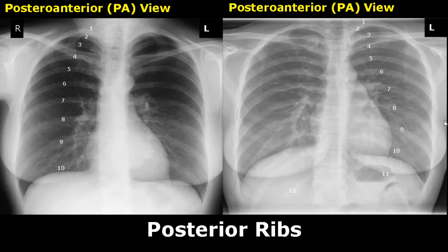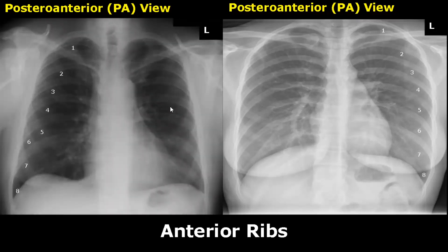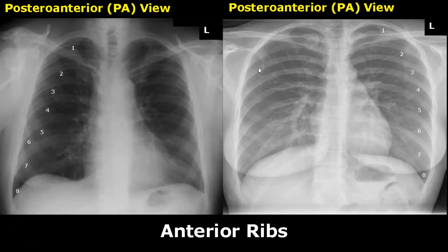The anterior ribs appear slanted and they are crossing over with the posterior ribs. Always remember that these slanted appearing ribs will be the anterior ribs on a PA view.